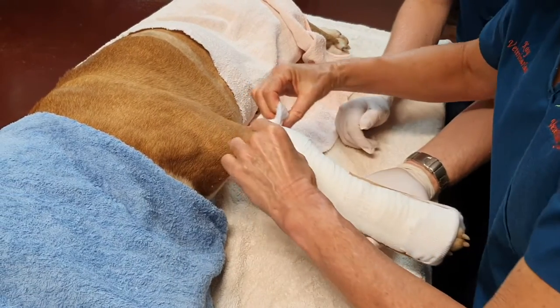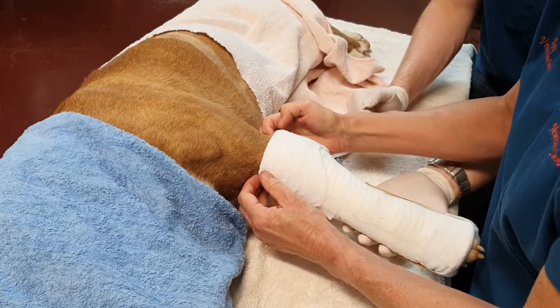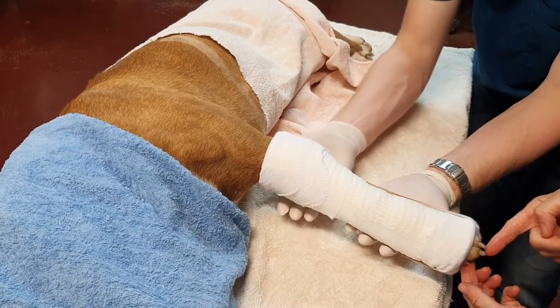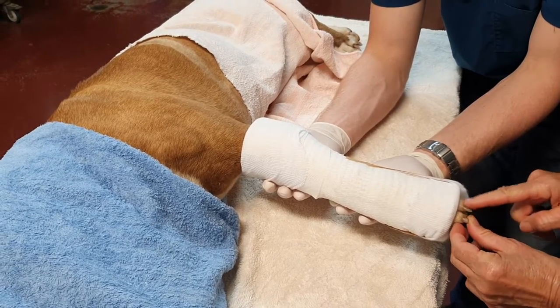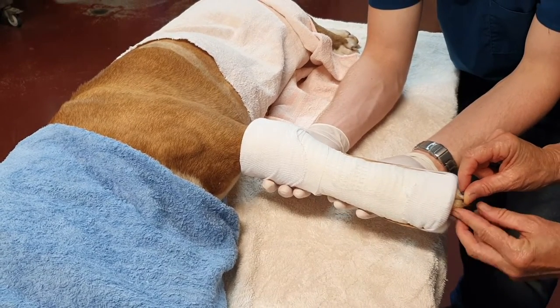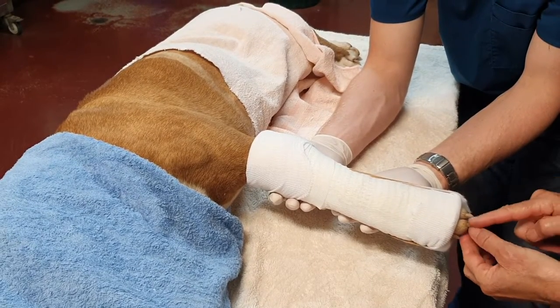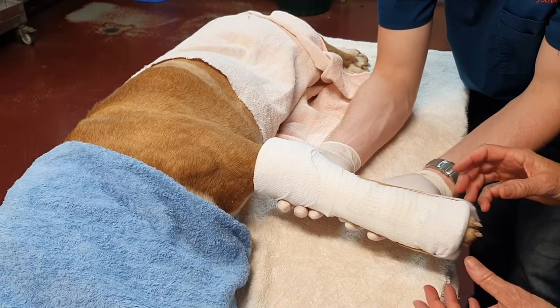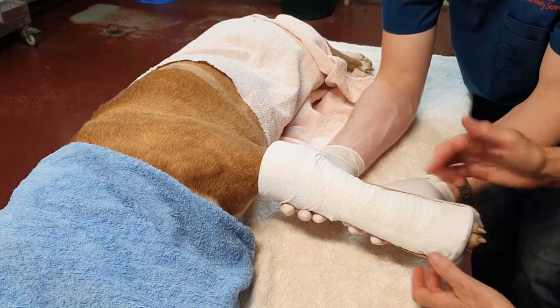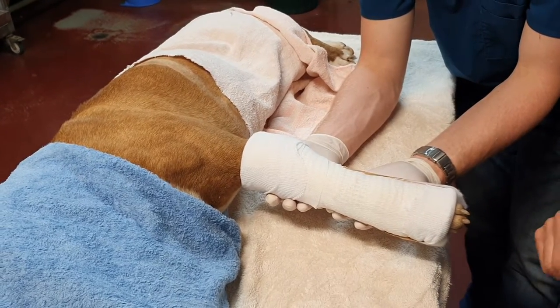We just fold that down and we've got a nice soft round edge up the top there, and we've got these toes that we can just see. I really like to be able to see toes — you can see there's still some soft band padding in there. If they start to swell or go purple, we know that the splint or cast that we've applied is too tight and it needs to be removed ASAP.